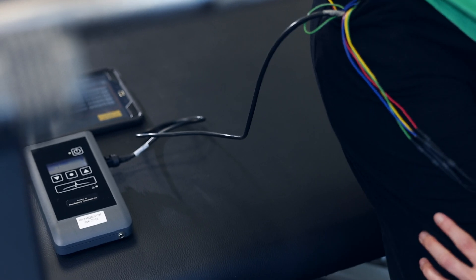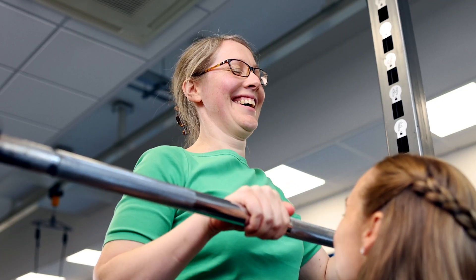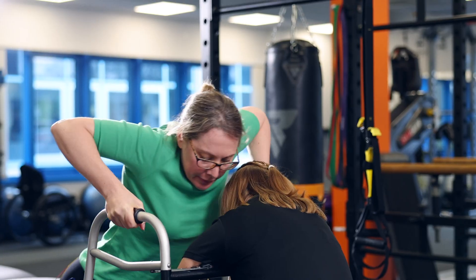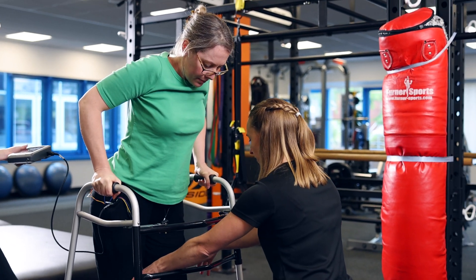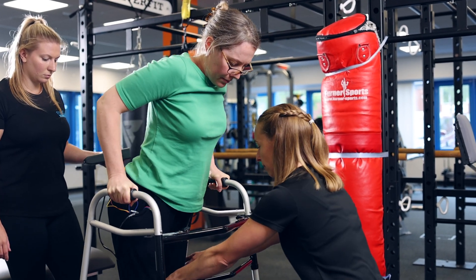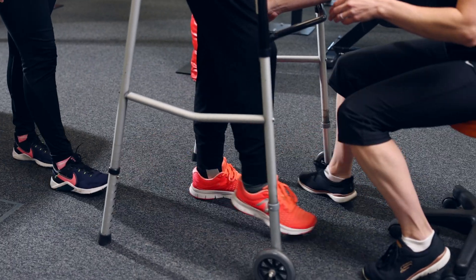Since using the stimulation, a couple of months in I started to notice more twinges in my quads, and they have just got stronger as the study has gone along. This has allowed me to take my first steps using a walking frame without any supports on my leg — which, when I first had my injury, was honestly a dream for me. It's something I always hoped I'd do, but to actually do it was quite an emotional experience.